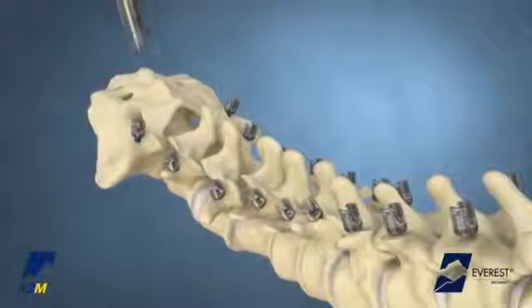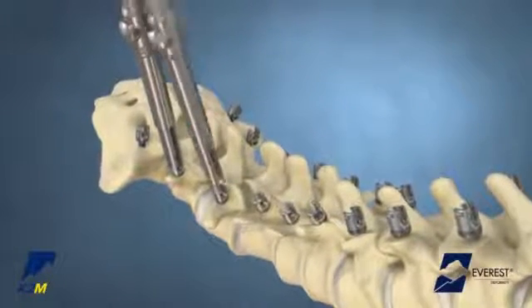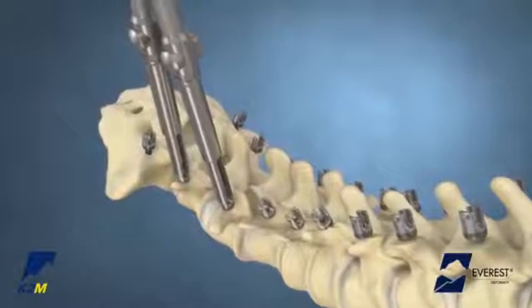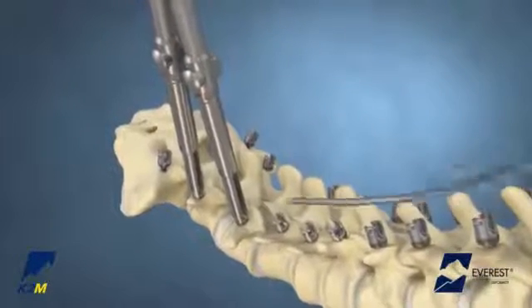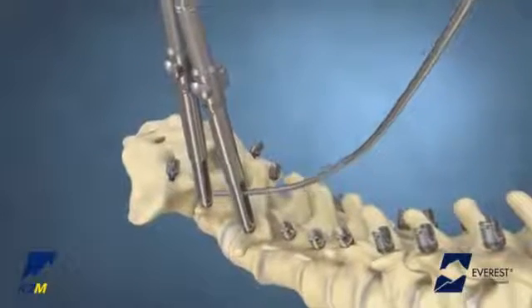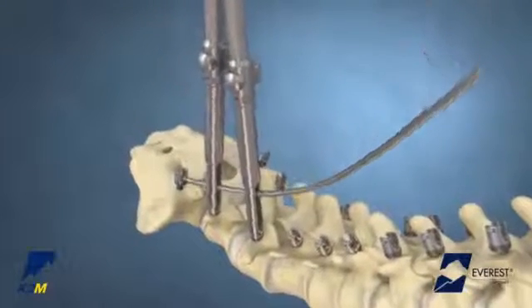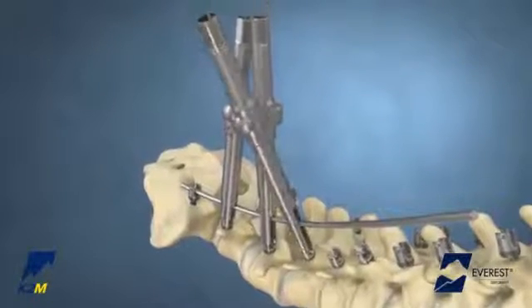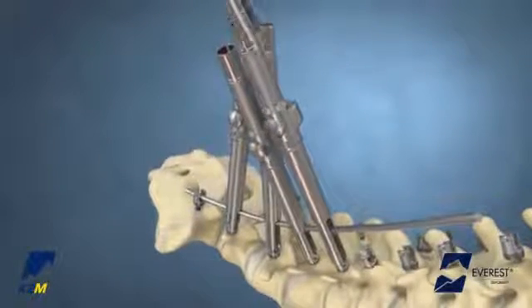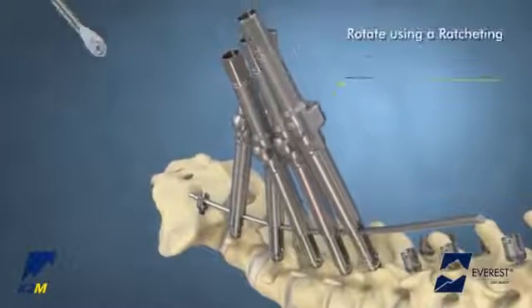For long constructs or deformity correction, place the Base Camp Tubes onto the heads of the screws to provide translation of the screws and spine to the rod later. Pre-bend the rods in the physiological sagittal plane and introduce the rod or rods through the tubes. Place additional Base Camp Tubes over the rod and onto the heads of the screws as needed, and rotate the rod into the sagittal plane.